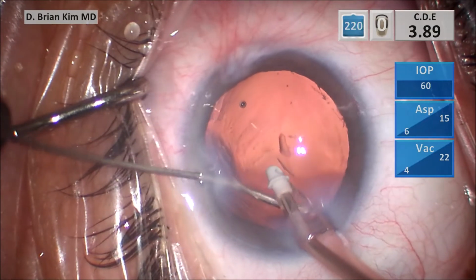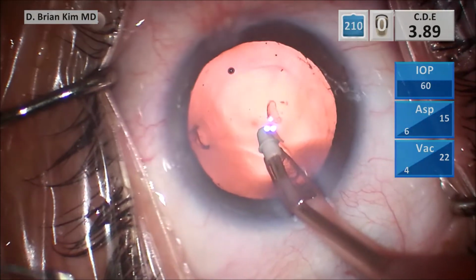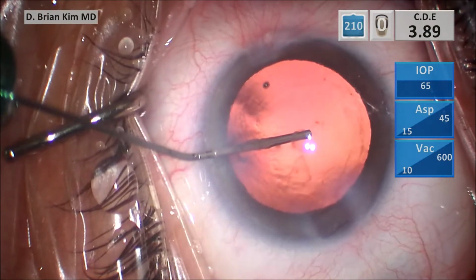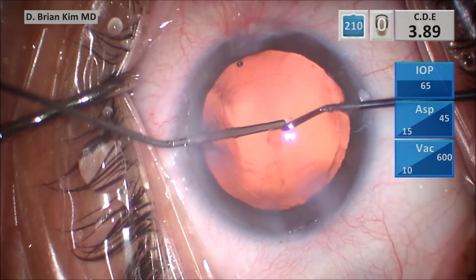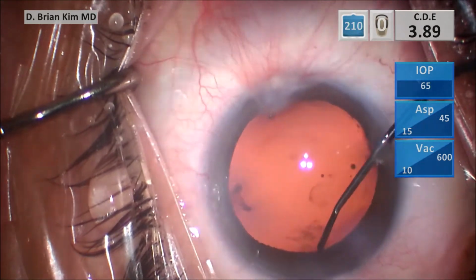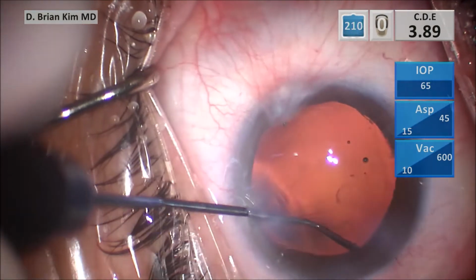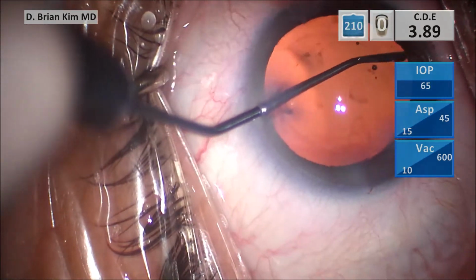So with irrigation on, I'm going to pulse the subincisional space with a cannula with BSS, and this allows me to ensure that the subincisional capsular fornix is nice and clean. I disengage the irrigation, and then I go ahead and push the cohesive viscoelastic to fill the bag. Then I polish with the sweep. I'm polishing under the rhexis edge to remove any lens epithelial cells, but also in the subincisional area. If I feel like there's a lot of lens material there, I go ahead and sweep deeper into the capsular fornix, but I can feel pretty confident that this bag is clean here.